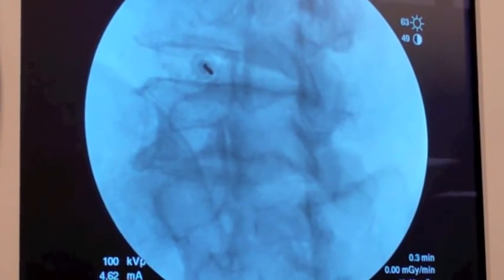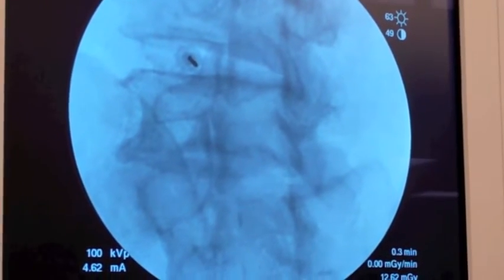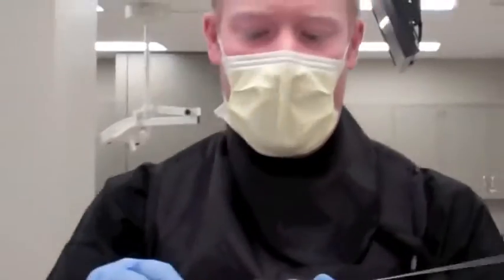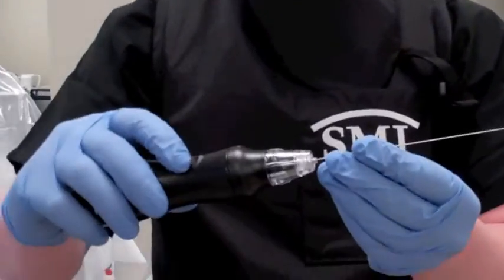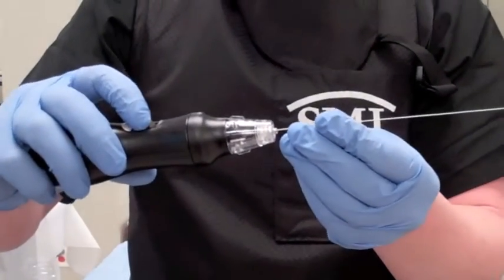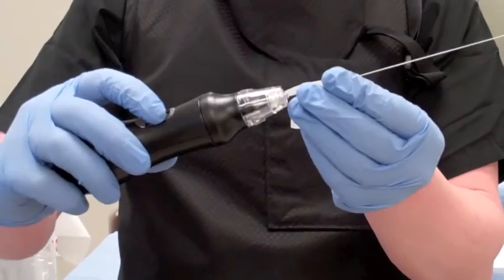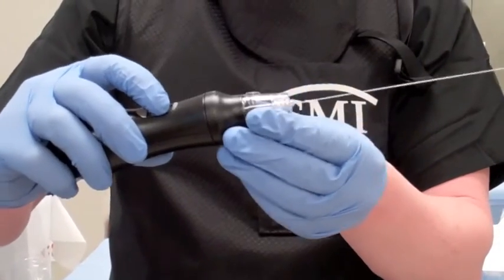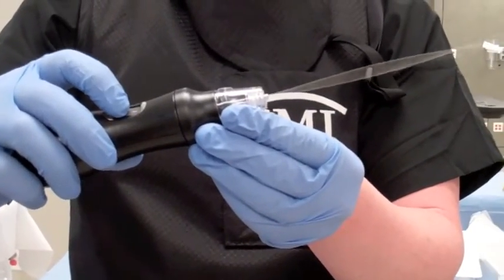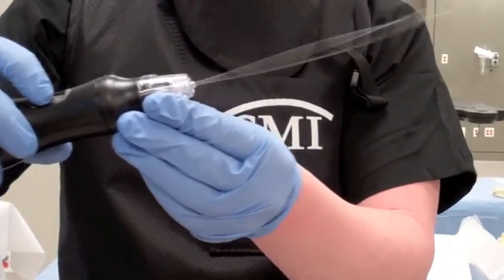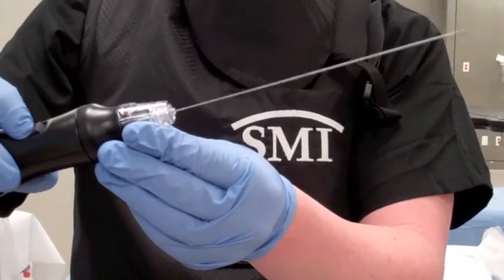At that point, I take another x-ray shot in a lateral projection. I now take the Stryker decompressor wand and I place it through the needle, and in a suctioning type action, it will remove this material in a spinning motion.